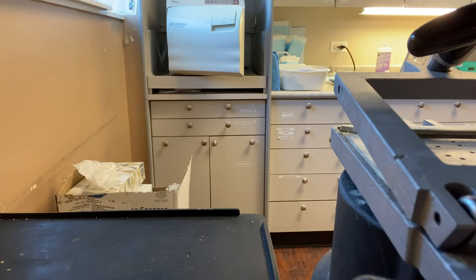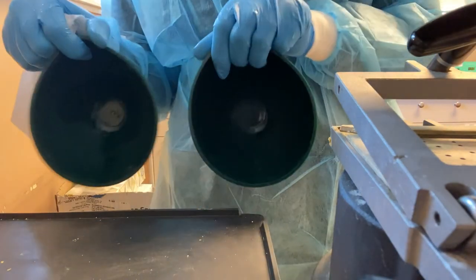I've come behind so many other assistants prior to me, and not saying that I always know what I'm doing or I'm always perfect, but I've made the mistake too. Sometimes we'll clean the bowls and there's still some alginate left in there. We'll clean the bowls, there's still stone left in there. So just make sure they're as clean as possible.